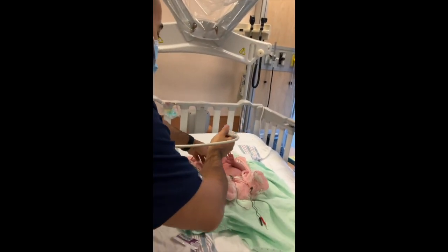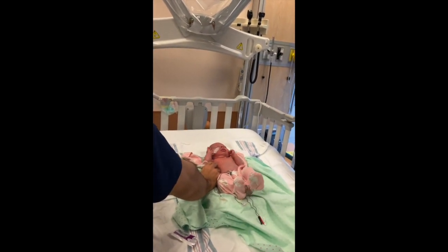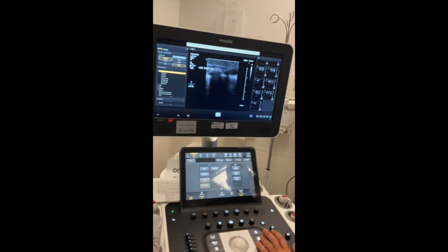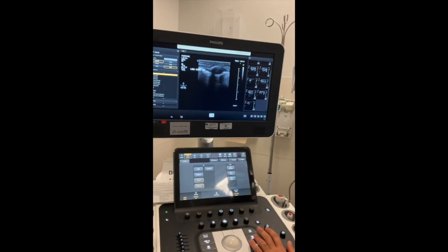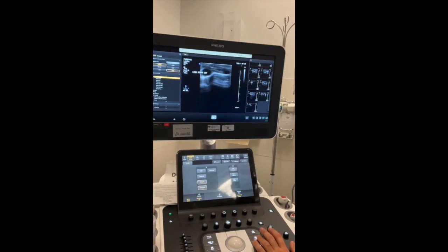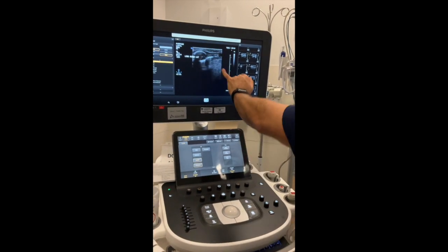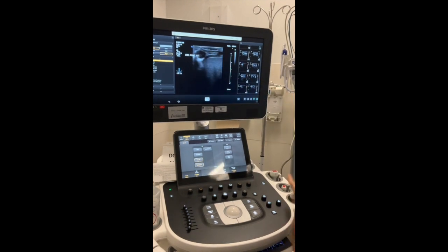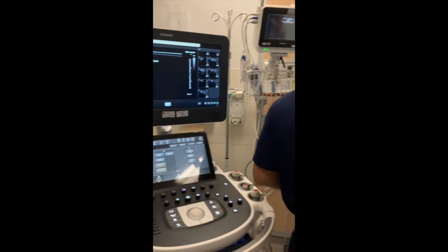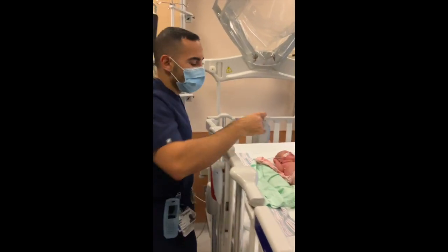I'm going to restart at the mid-clavicular. We can see nicely that there are ribs and A-lines, and as I go down I can see the liver and the diaphragm here. And that's it — we've done a unilateral right-sided lung ultrasound.